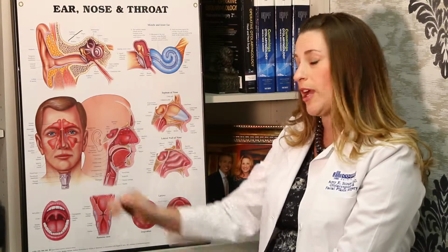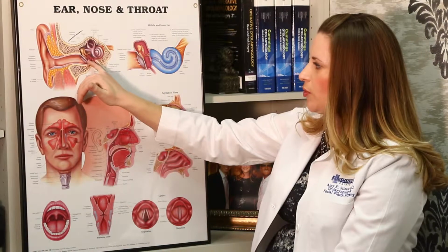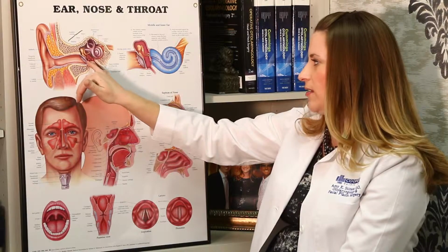We're able to use the microscope and look directly at the eardrum. When we do this, we're able to clean out any wax or any debris that's in the ear canal. We then place a very small incision in the eardrum. Through this incision, we can suction any fluid that has remained behind the ear or any infection. So if your child does have continuous ear infections, it's still okay to perform this procedure while they are infected.